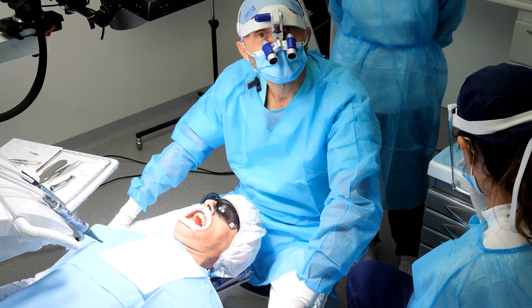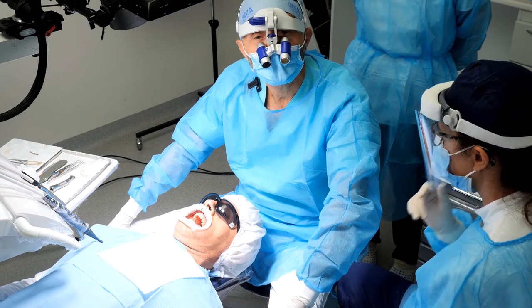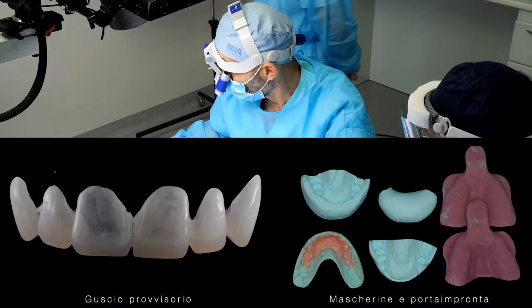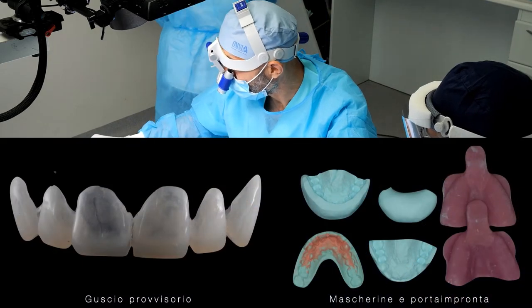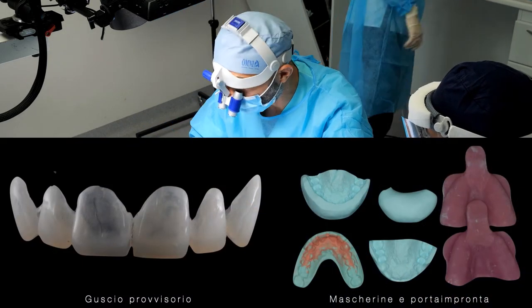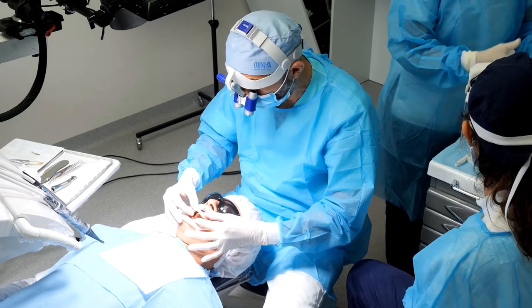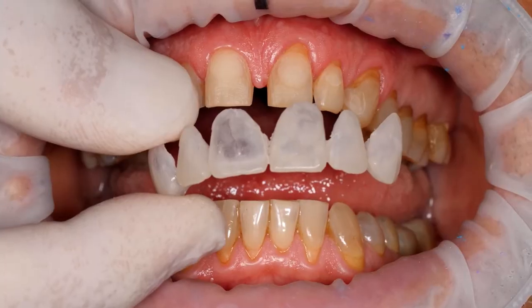Dr. Beccarini, now we are going to fabricate the provisional with two different techniques. As we have said, the shell for the provisional, for the veneers, is always extremely critical because the thicknesses are really minimal.